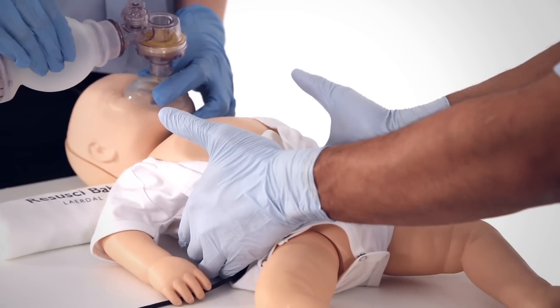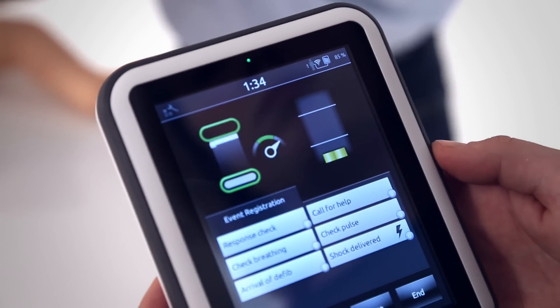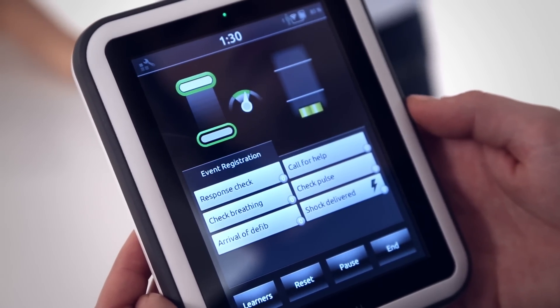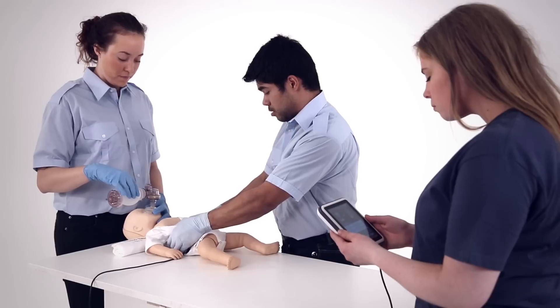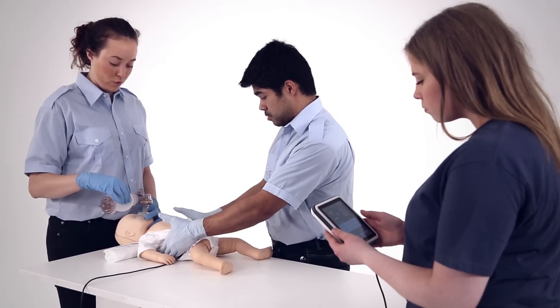Reisussi Baby can also be used with Sympad Skill Reporter for live feedback on CPR. Adequate compression depth, release, rate and correct hand positioning are reported throughout and summarised after the training session.